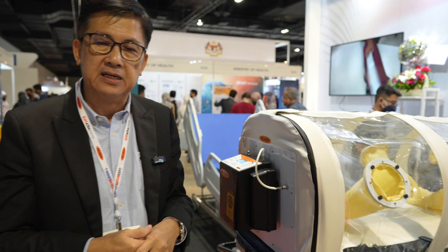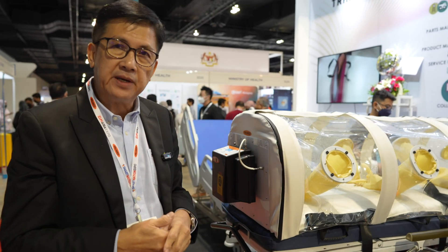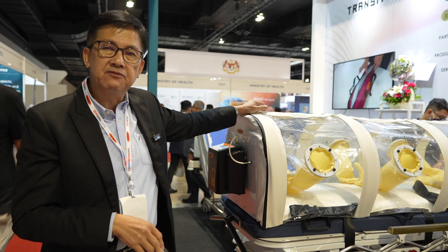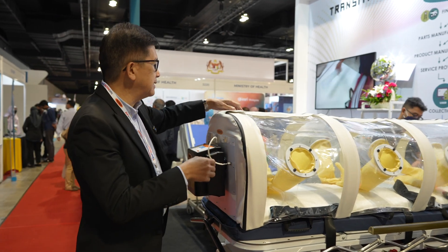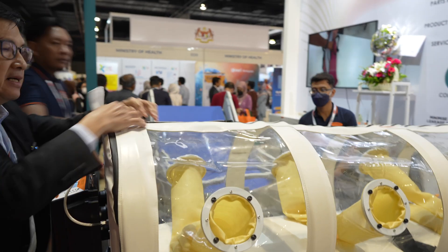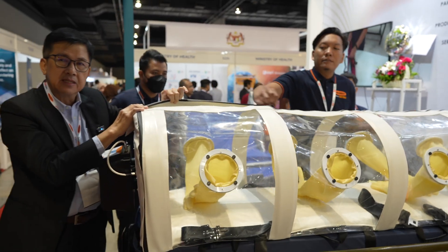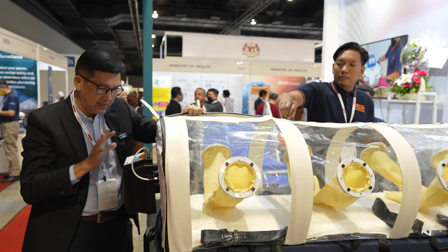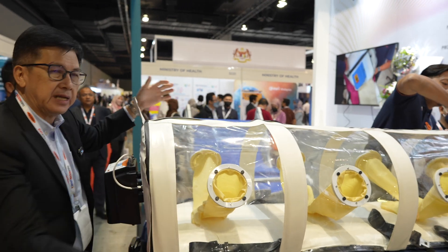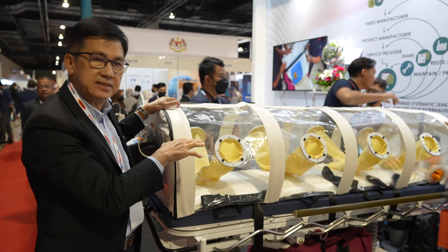So a COVID patient can be placed inside and transported safely from point A to point B. When we open it up, you can see these are airtight zips. If there is a leakage, there is an alarm here to alert us, and the carrier can be opened up so that we can put the patient inside easily.